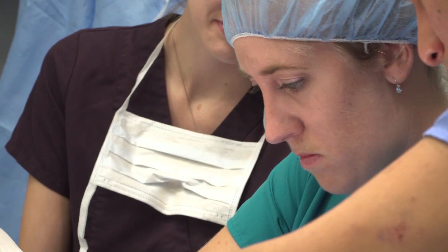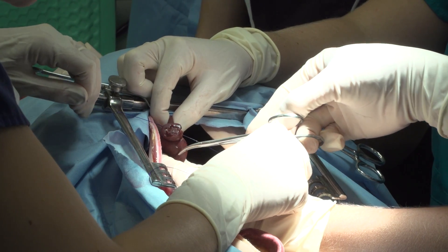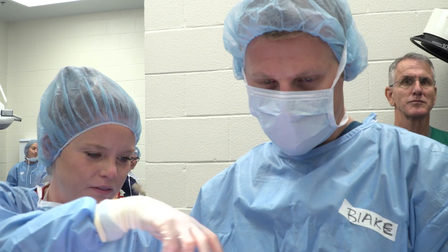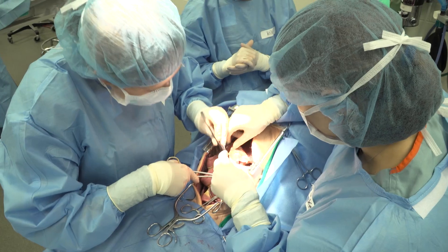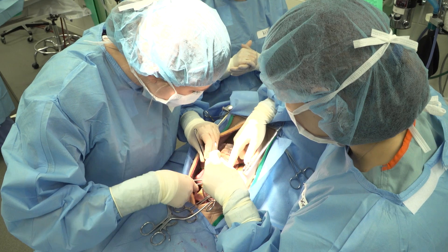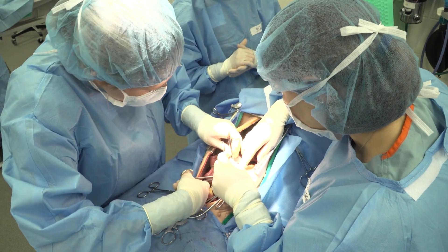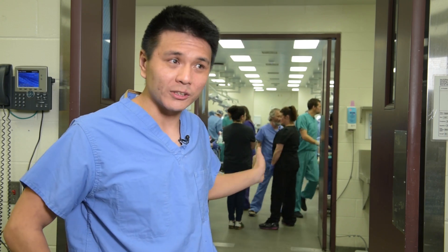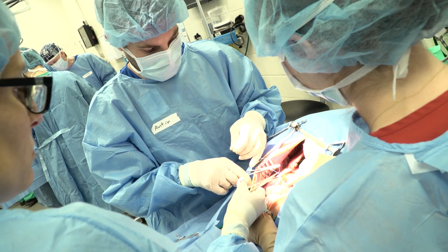This is going to make the students better veterinarians in the future by giving them the hands-on experience as the primary surgeon. Without this, they would go into practice without any sort of experience whatsoever with gastrointestinal surgery, and new graduate veterinarians are expected to be proficient in procedures like this. As soon as they graduate, they've got to hit the ground running.